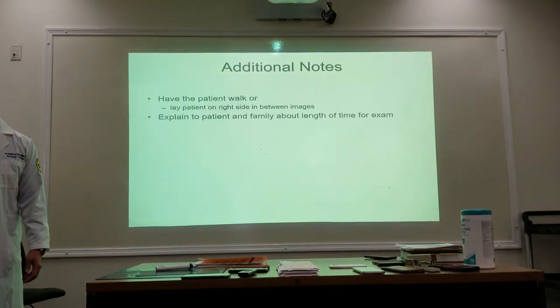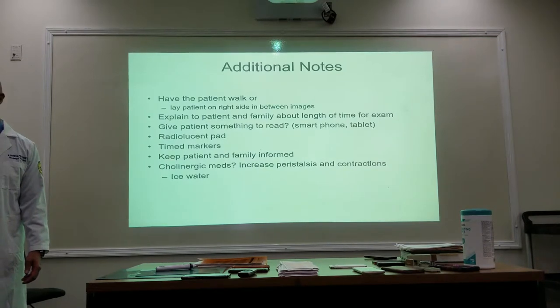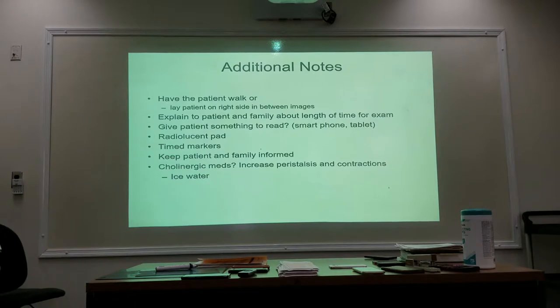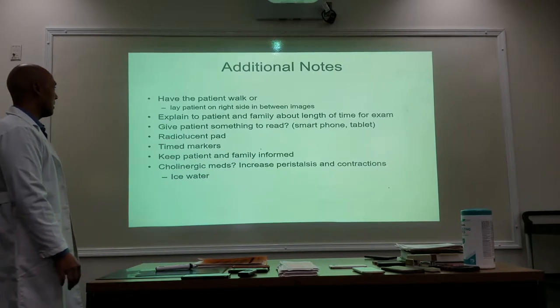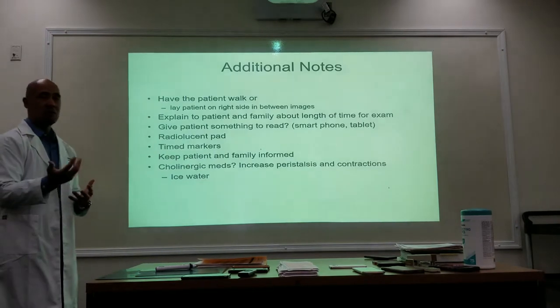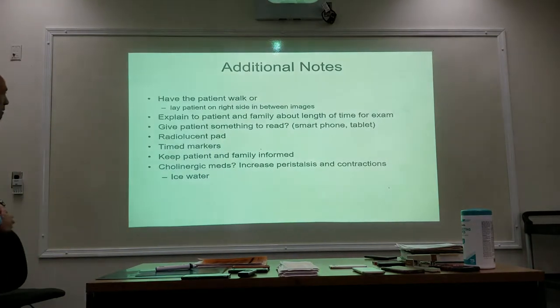All right, so some additional notes. Again, this is a reminder: have the patient walk or lay on the right side in between images. Explain to the patient and family the length of time of the exam. Give the patient something to read. Make the patient comfortable; if they're going to be laying there for a long period of time, make sure there's a pad on that table. Have your time markers or be ready to annotate your images accordingly.